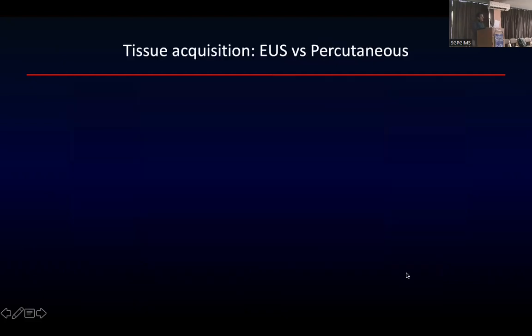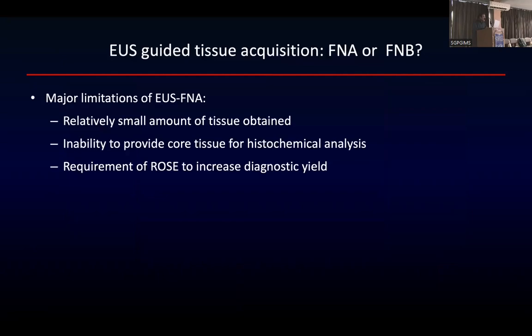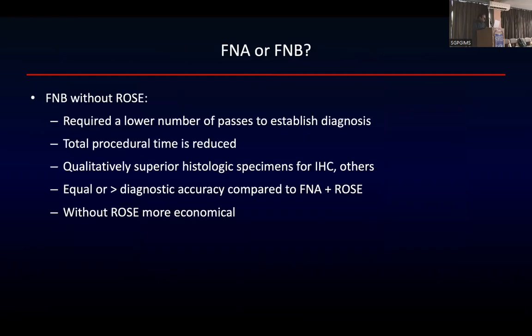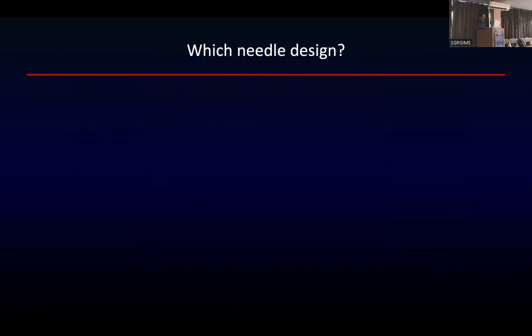So I think I can go on. I have a lot of slides, but I think we will go to the live cases. Is that okay? Or should I continue with this? So now I think technical part I have highlighted. FNB, FNA. So just to tell you that now FNB will be the norm, that I will tell you.